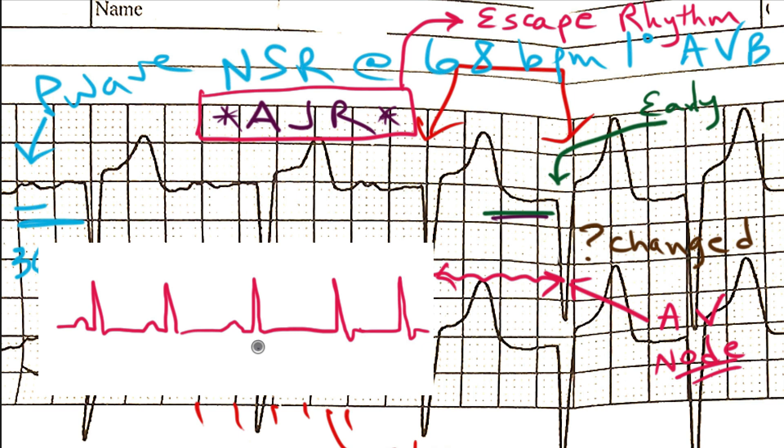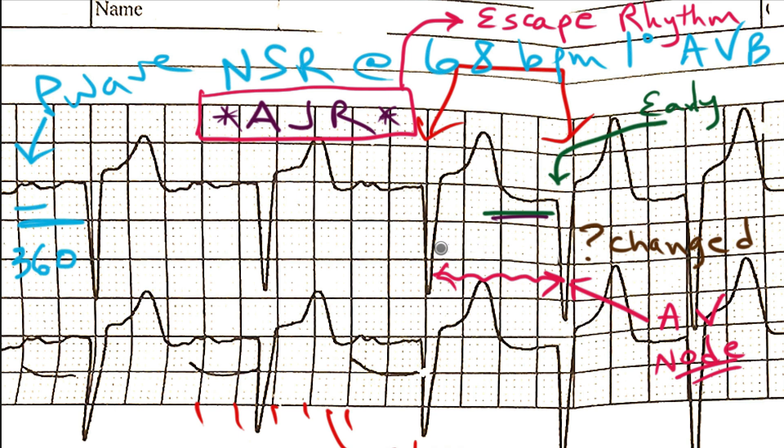If that's the case, then the first beat of this accelerated junctional rhythm would wind up being late because there's no P wave here. And with no P wave, then the AV node kind of takes over. But what differs here is that this QRS complex doesn't come late as an escape rhythm. It comes a little early.